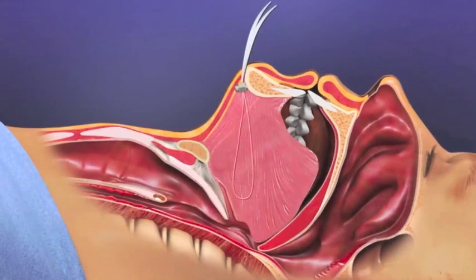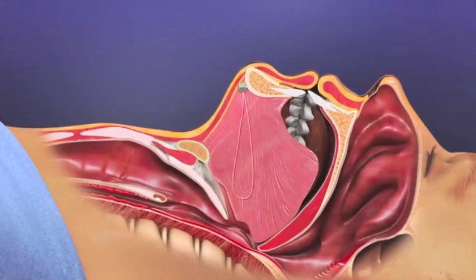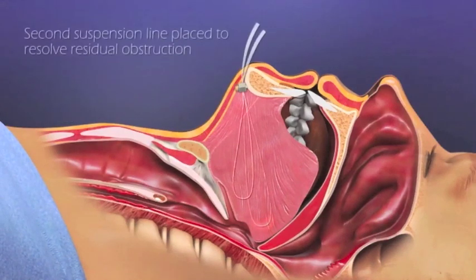Tension is placed on the suspension line to advance the tongue to prevent it from falling into the airway. The suspension line is then locked in the bone anchor and the advancement is maintained.